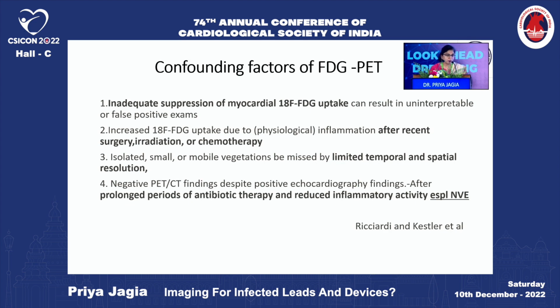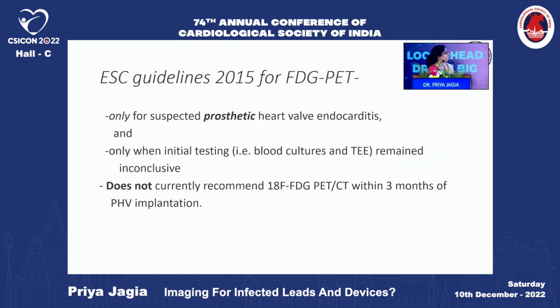So the inadequate suppression, the preparation of the patient is very important in the FDG PET. So false positives may be there. Also, if the patient has had a recent surgery, then again because of the edema, there may be an increased FDG uptake. So that has to be kept in mind while reading it.